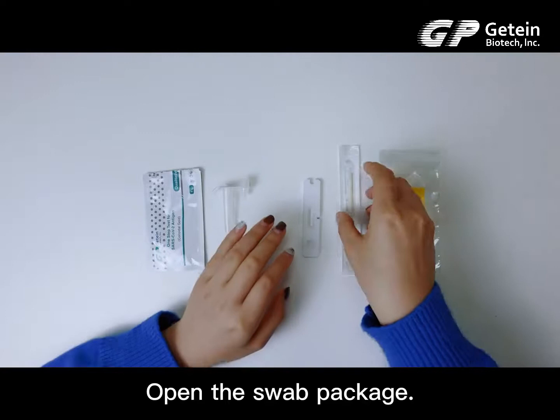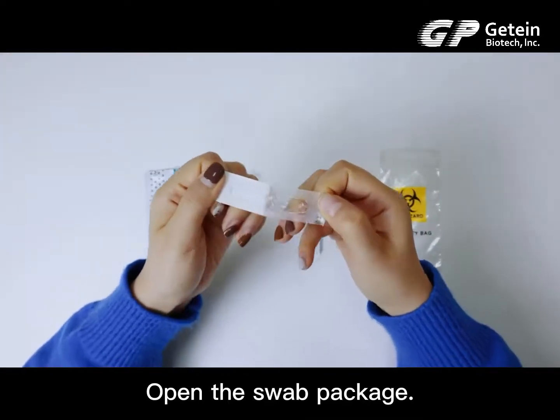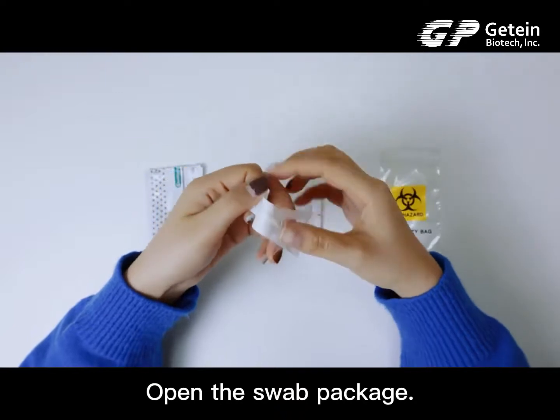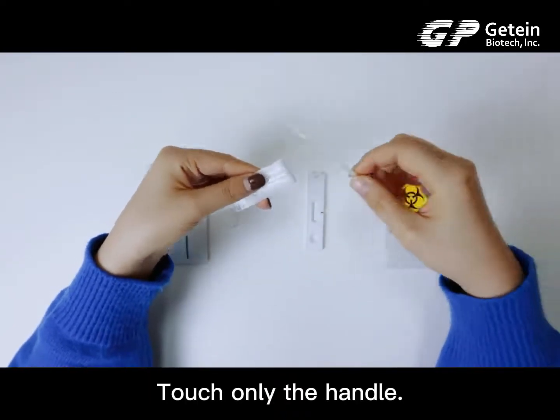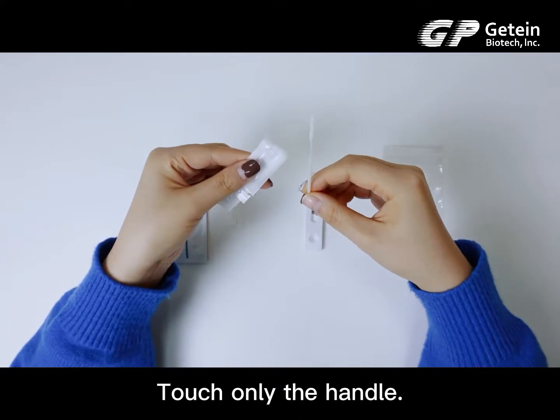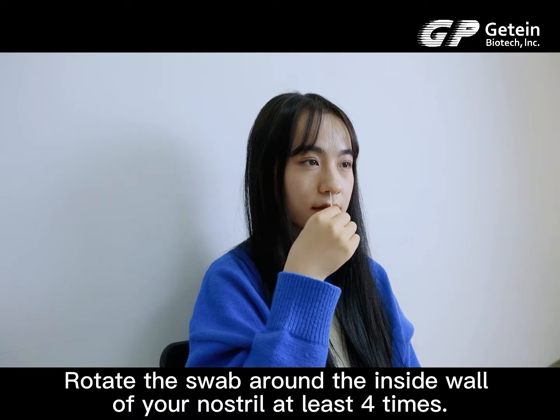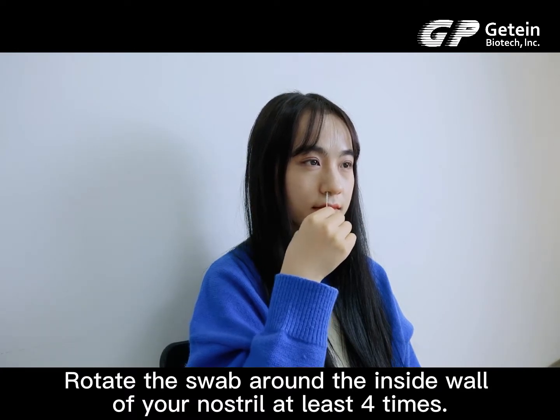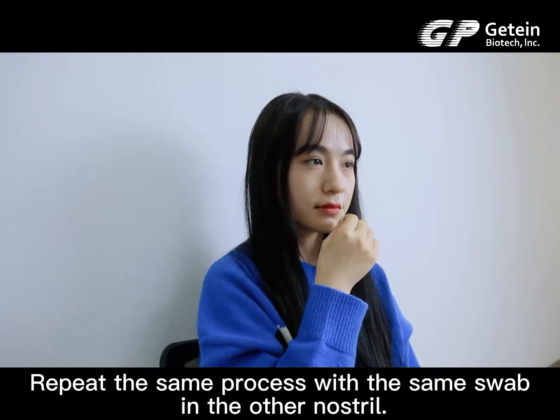Open the swab package. Touch only the handle. Rotate the swab around the inside wall of your nostril at least 4 times. Repeat the same process with the same swab in the other nostril.